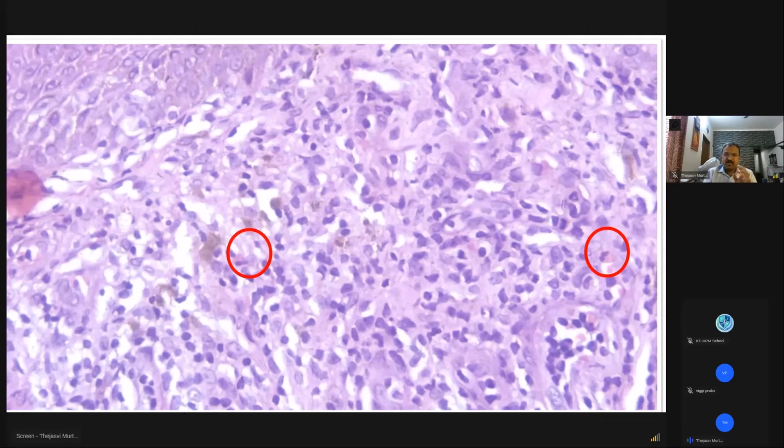It's the dermal inflammation, where you're seeing the band-like lymphocyte infiltrate, or lower down, or around the blood vessels, or closer to the epidermis. You have to see eosinophils. You can identify these eosinophils by their cytoplasm and the bilobed nucleus. So these eosinophils, along with an exaggerated lichenoid response, that is exaggerated interface dermatitis, where the inflammation is going high up, close to the granular layer, then you can identify this as drug-induced lichenoid change.